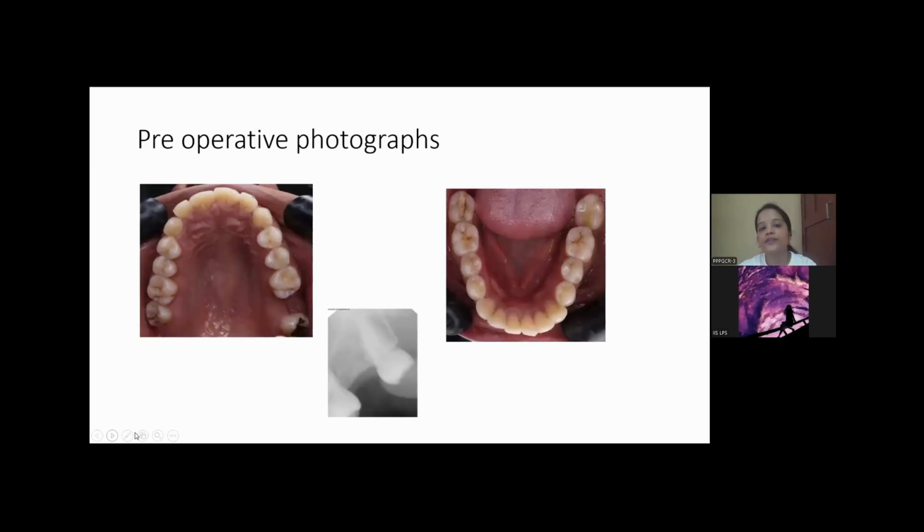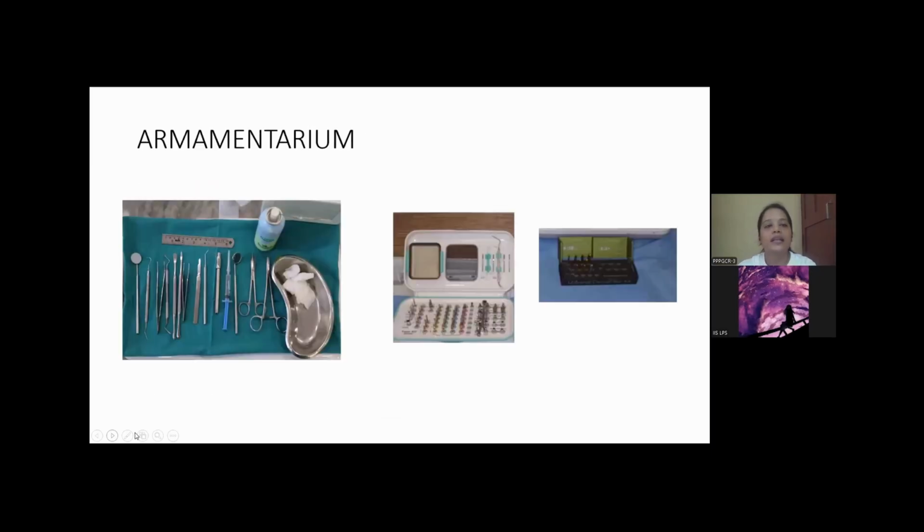These were the preoperative photographs of the individual. And in this, we have selected an implant size of 4.5 by 10 mm.